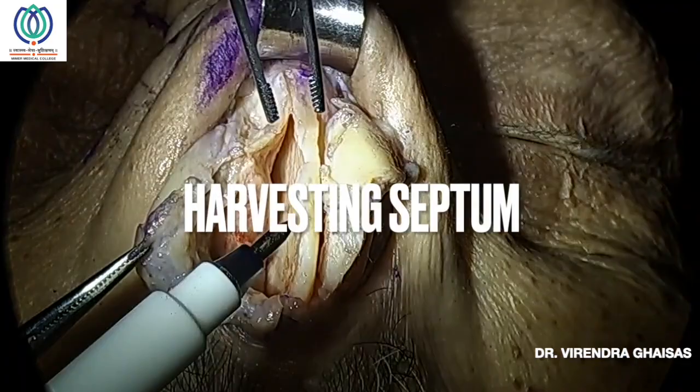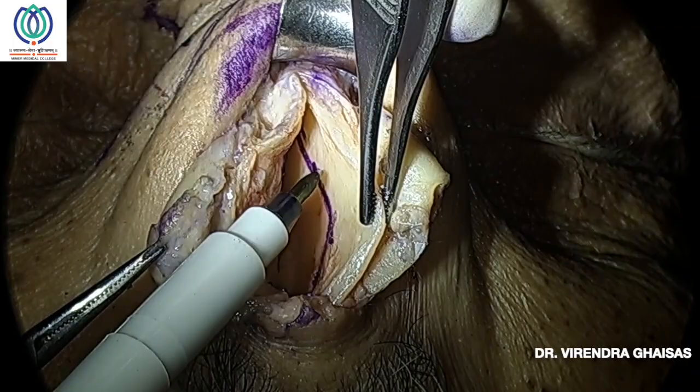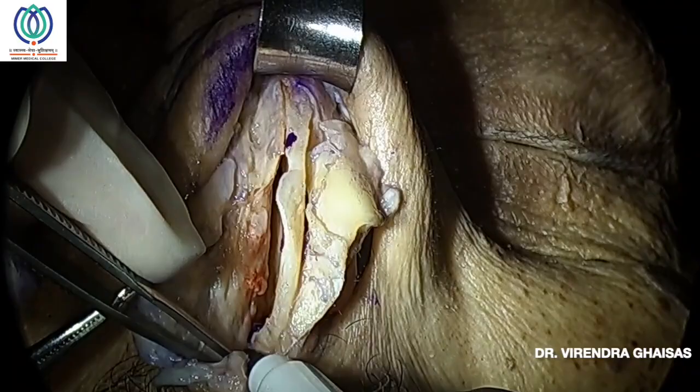Treating caudal dislocation is very important. The main treatment is the swing door technique, where you relocate the deviated part of the caudal septum to the opposite side, drill the spine and suture it.